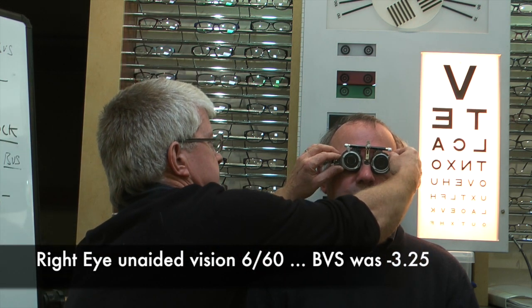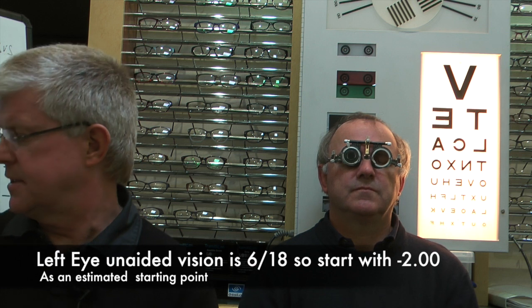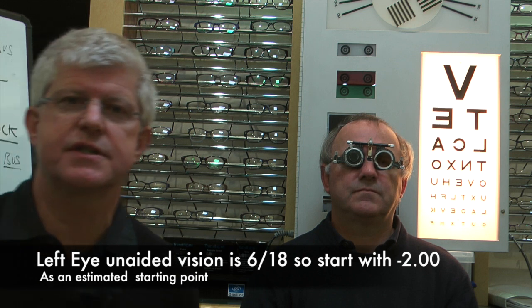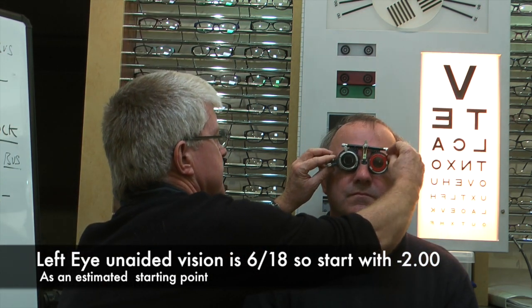So we're going to take that out. We know that he is myopic — he's short-sighted — so we're going to start, similar to the way we did before, with a minus 2 and we'll just see where we go. So Alan, I'm going to put a minus 2 into the trial frame. Can you look at the chart and let me know whether that is better for you? A lot better — I can read all the chart, no problem. I can read the bottom line quite clearly. So with minus 2 he's able to get right down to the bottom — that's very good.